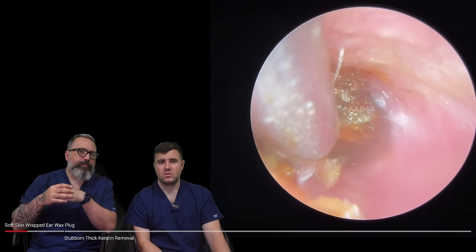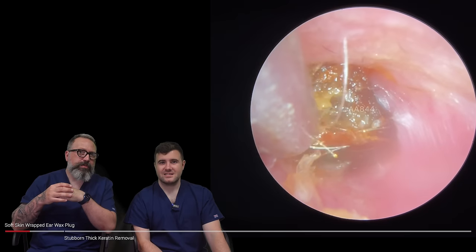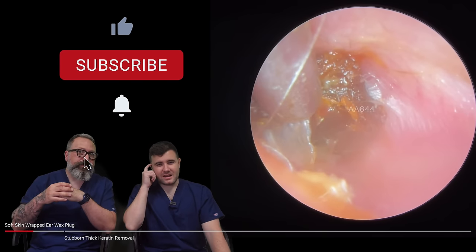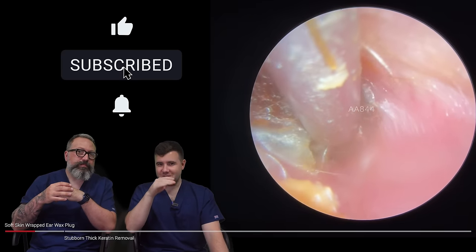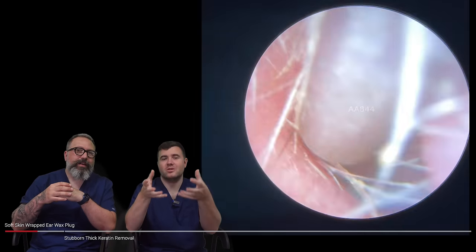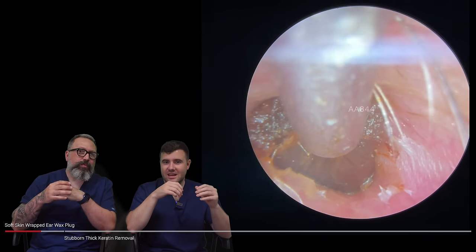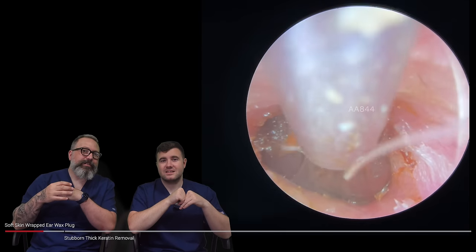Oh yeah, just uncovered — it's almost... let's see if we can hold on to this piece, it's really wedged in there. I kind of love and hate doing these ones at the same time, because when you start seeing them peeling away down the ear canal and then you see it detach — oh, here it comes! But then at the same time you get these little bits that are still attached that start making it whistle.